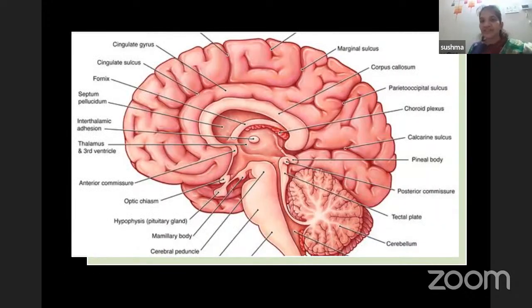Now we are done with axial planes and we are moving on to the mid-sagittal plane. As I mentioned before, there are axial planes, sagittal planes, and coronal planes. The three most important planes are the axial planes, and those three axial planes are the ones included in the anomaly scan.